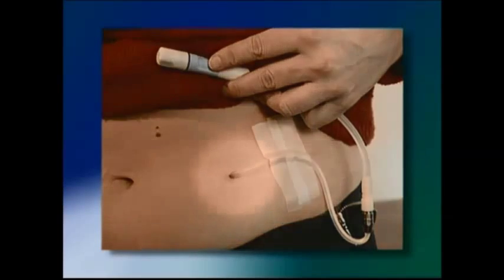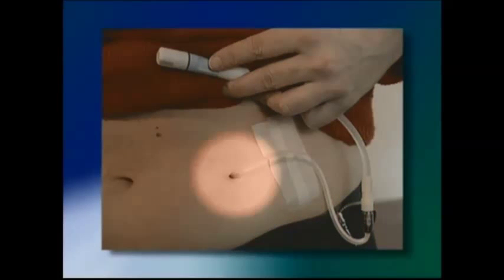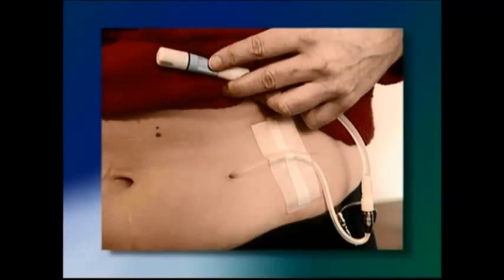The skin around the catheter must be cleaned regularly to make sure it doesn't become infected. Your dialysis nurse will teach you how to do this.